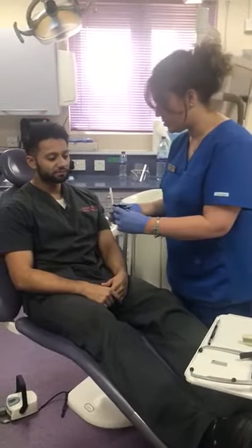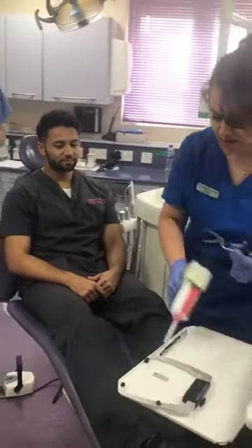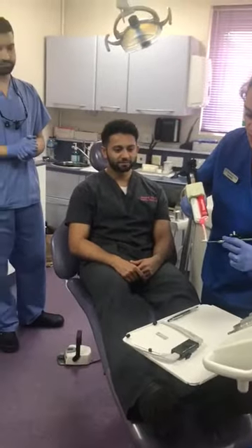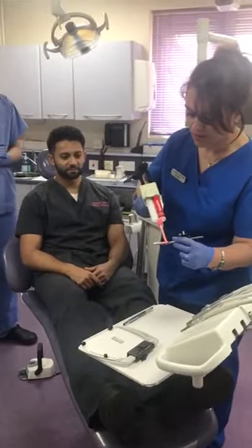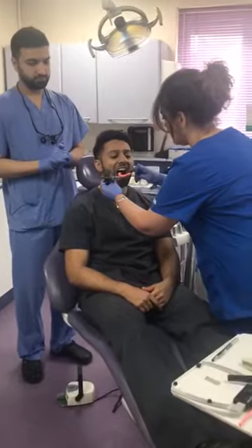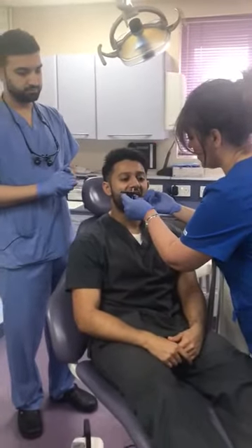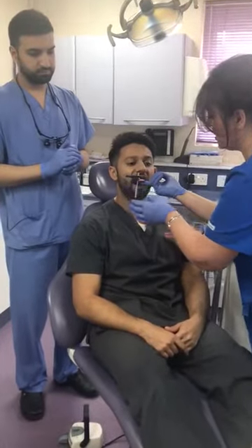This bit goes between the two front teeth, it goes between the two centre lines. Normally I use a stone bite, so I just run that quickly across like that, then I put that over the teeth — open wide — and I try and locate the centre line in the centre and hold it there for it to set.